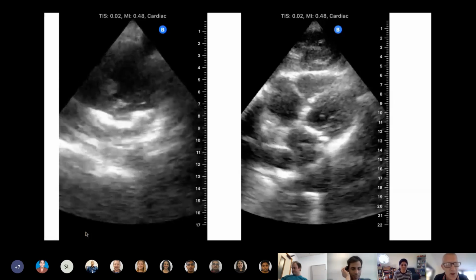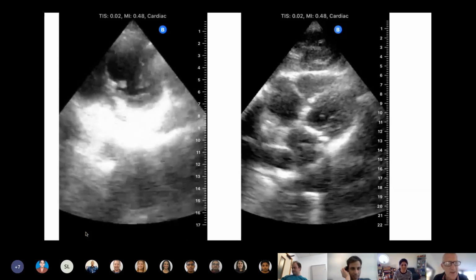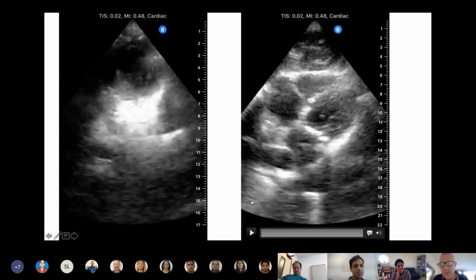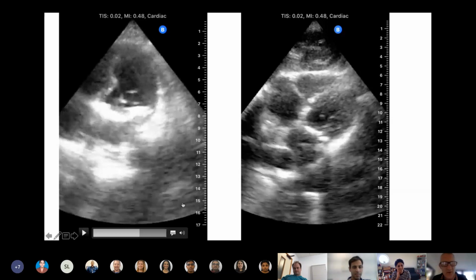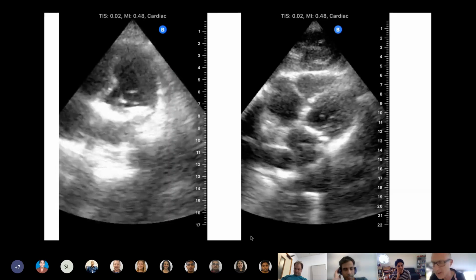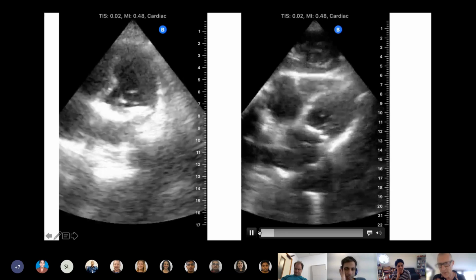I took some more images as well in slightly different views of this, so you can get a better picture. But there is some contraction. It's not perfect. However, I realize that the go-to view in this care setting is the subcostal view, because the patient's lying flat for the ideal one, and you can definitely get people lying flat in a care home. So this is my subcostal view.